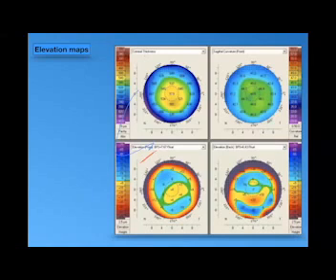So you have a regular 49, no difference, no problems in the elevations of this patient, stable refraction and good vision, the best corrected visual acuity is good, the age is good, and the follow-up period before going for surgery is good. You can go for surgery without fear. But about the flap, I will go for a femtoflap if I can, for safety, to protect myself from buttonholing.